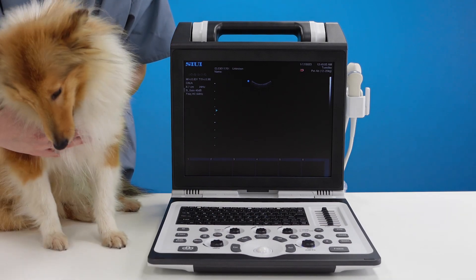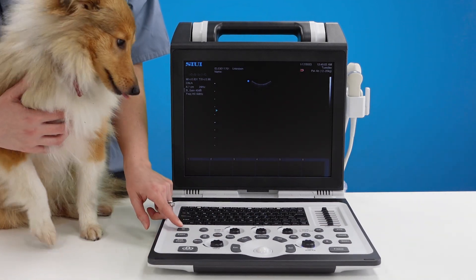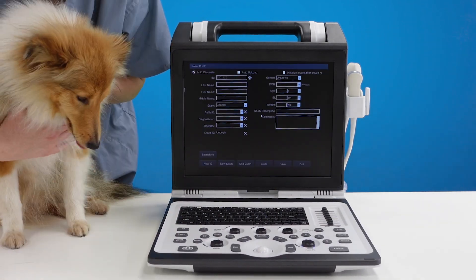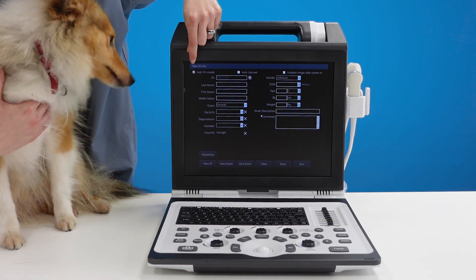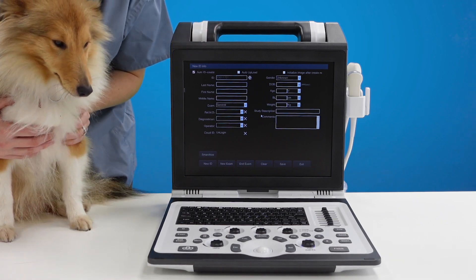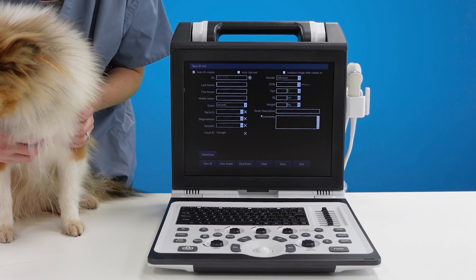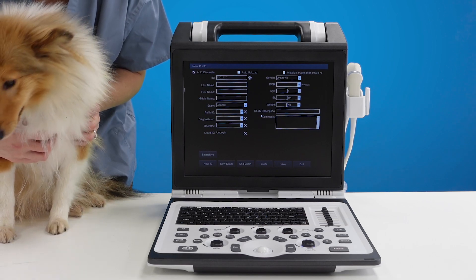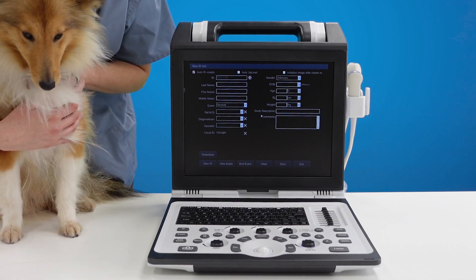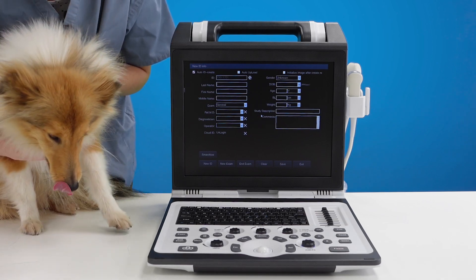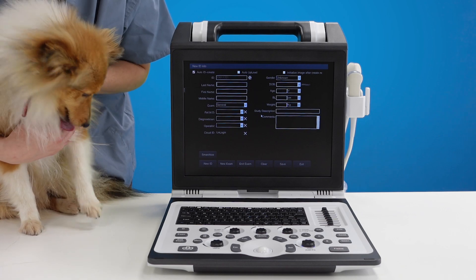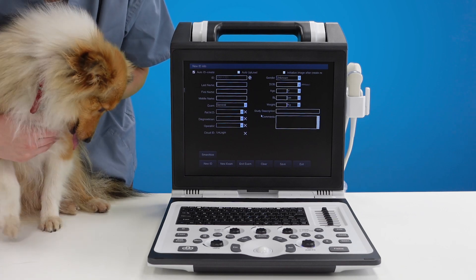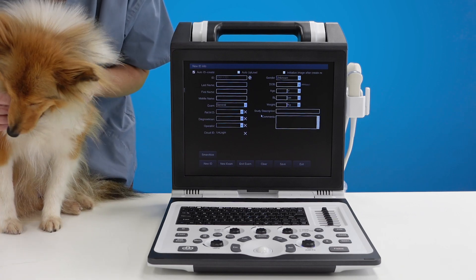If you want to enter patient information press the ID button. You can untick the auto ID if you want to type in your own hospital ID numbers or practice ID numbers. Otherwise you can leave that ticked. It will auto generate an ID for you and this is where you can put in as much information as you like.